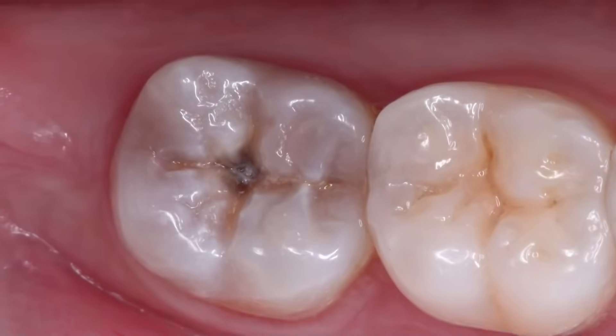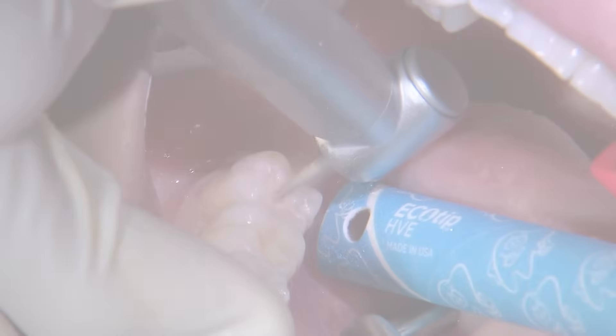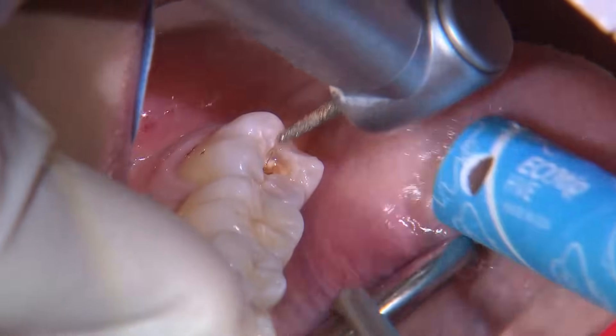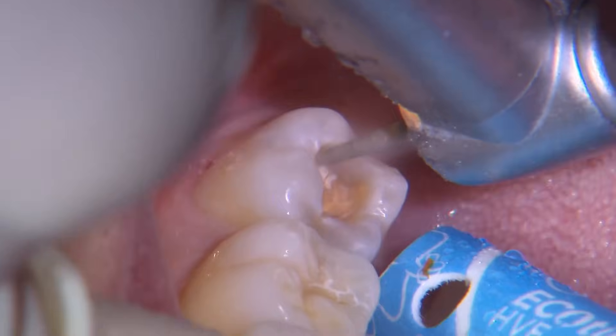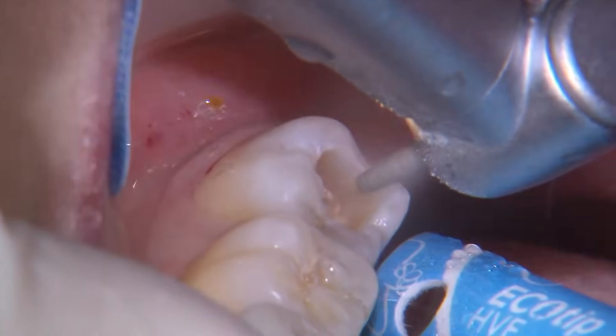The objective for any caries removal is to first identify the extent of the decay. Here I'm using a medium grit round and tapered diamond to extend the preparation in all directions until I locate uninfected DEJ. You are able to use any gross reduction burr of your choice. Because I'm focused on the DEJ initially, I only have the burr extend to a depth of about two millimeters.